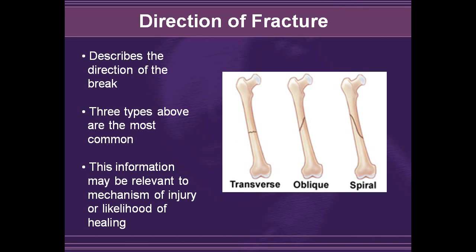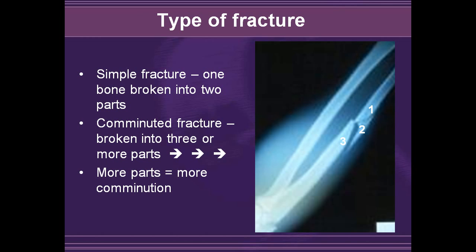When describing the direction of a break, a transverse fracture is exactly perpendicular to the direction of the bone. Oblique and spiral fractures are as described on the images — those are the most common. The information may be relevant to the mechanism of injury and may give indications to look at other bones or soft tissues for additional injury. A simple fracture is where a single bone has broken into two parts, while a comminuted fracture is where the bone has broken into three or more parts. This is an example of a comminuted fracture with three portions.